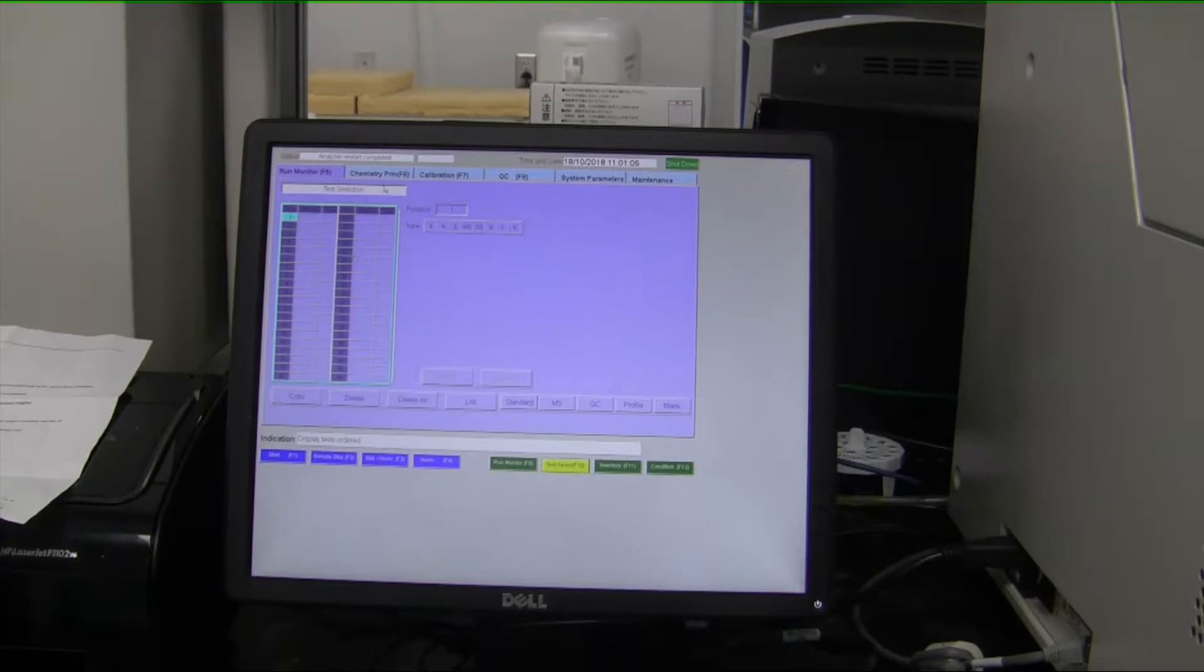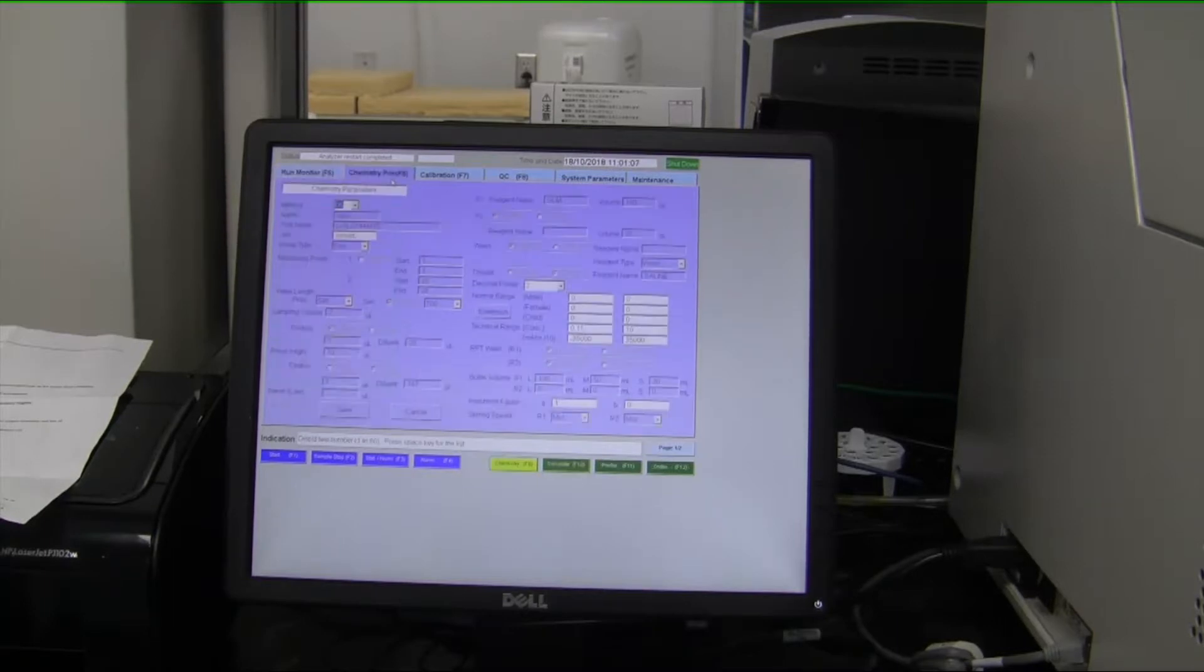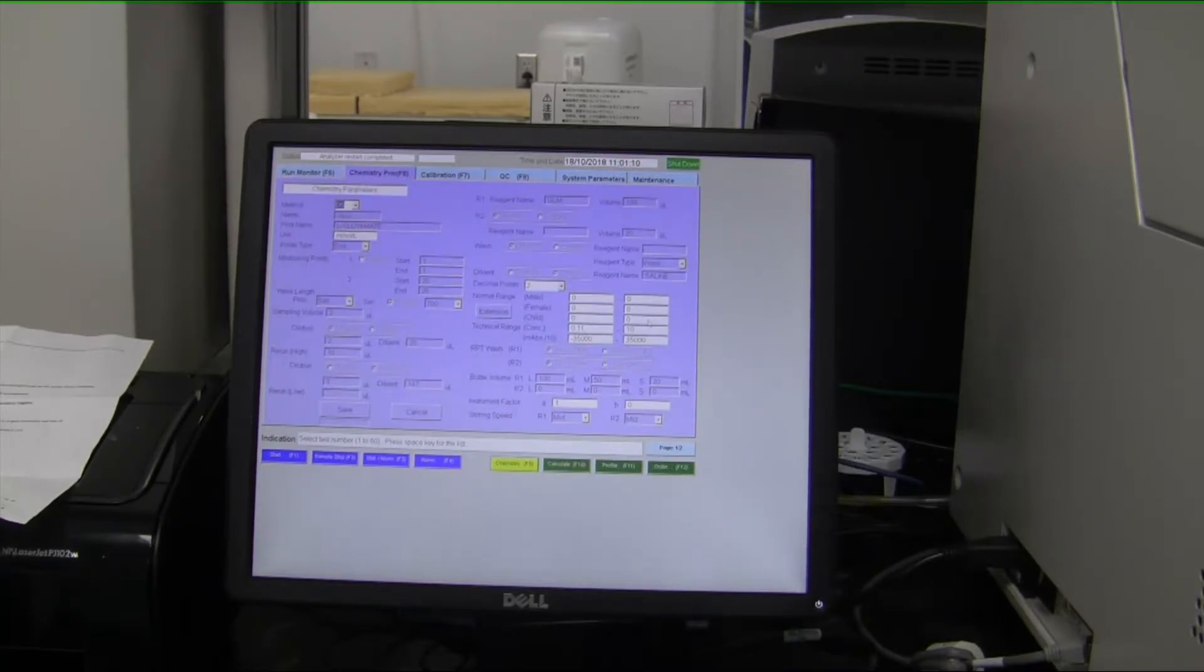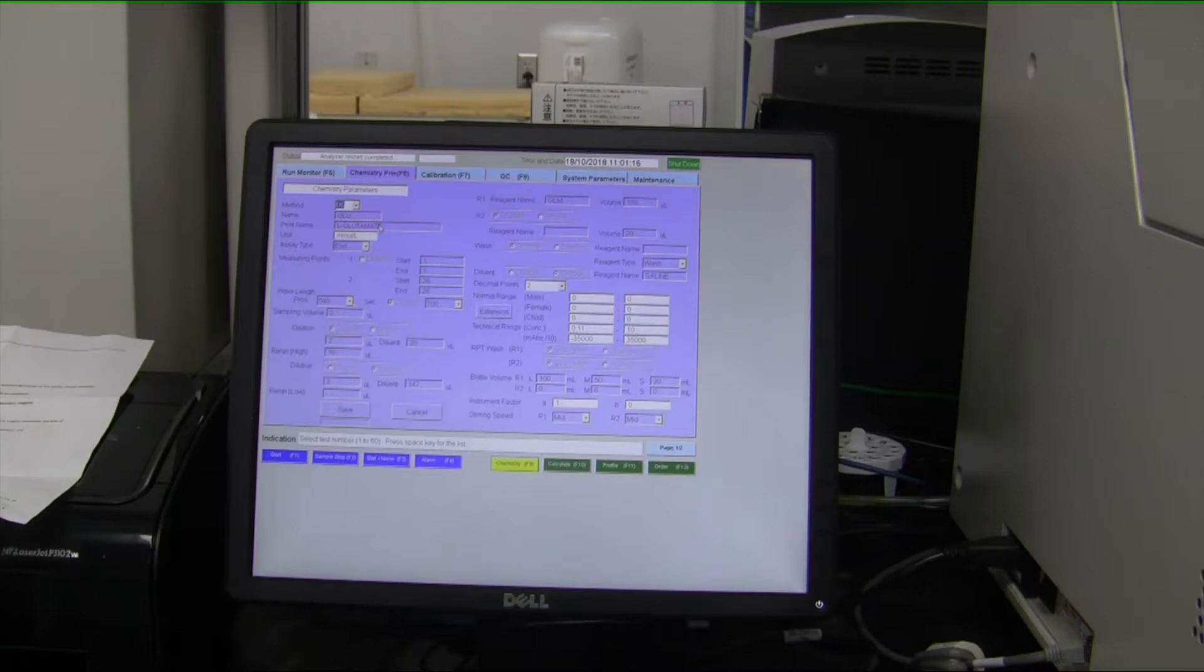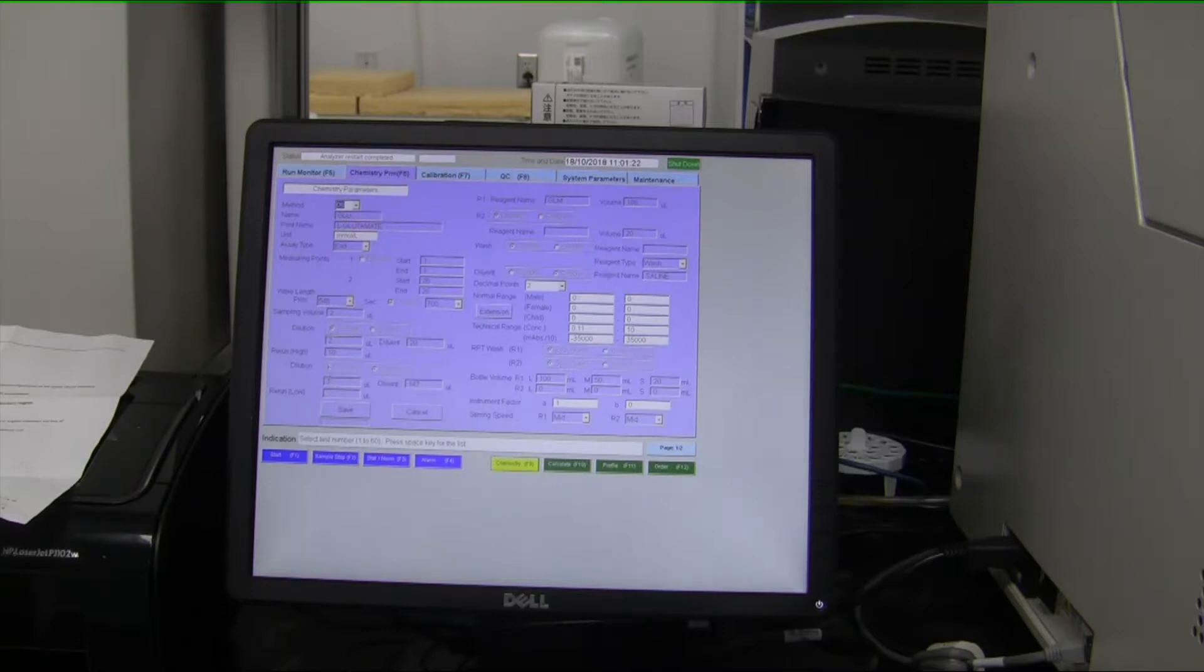If you wanted more advanced information about what the machine is doing in the background, chemistry parameters will tell you all about each specific metabolite, what its measurement units are, how much sample, and how much reagent is being put into the cuvette, and what specific optical frequency at which the measurement is being done. These things are all being done in the background of the instrument.